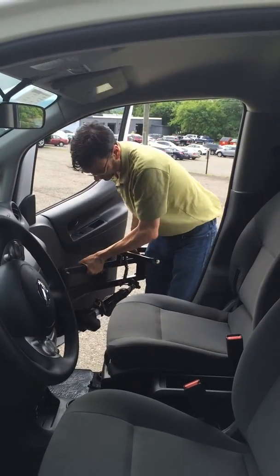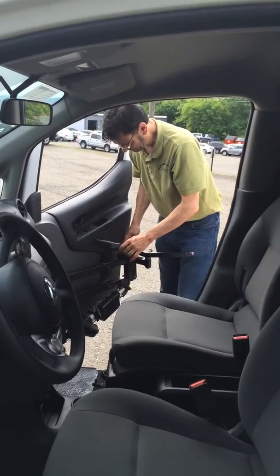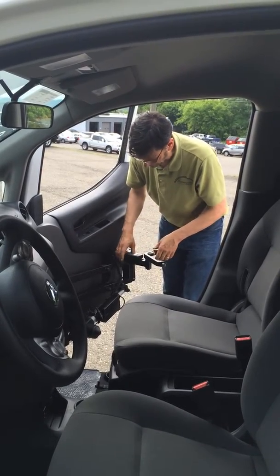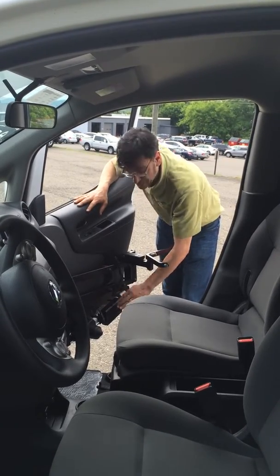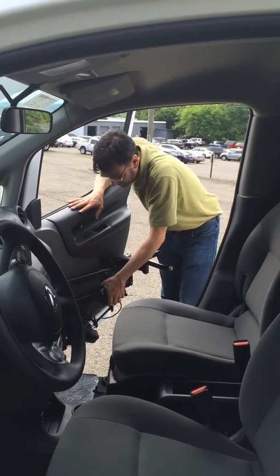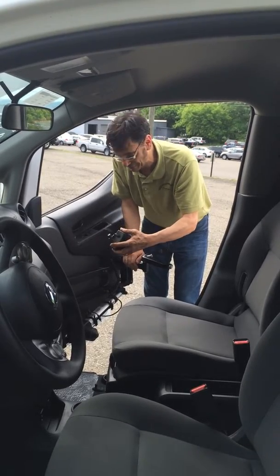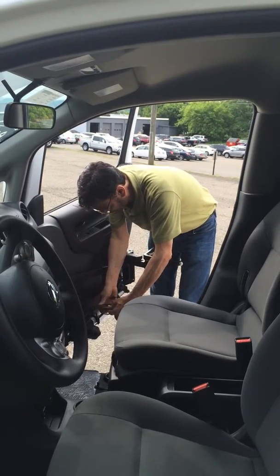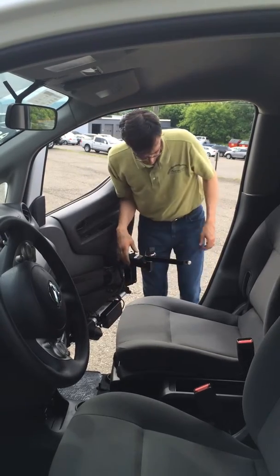Our next step is to put the Multilift on the speedy bar. This is your controller, which allows you to go up and down. You'll notice this unit has the integrated battery system, so there is no battery hookup whatsoever. You simply lift the lift off. If you ever needed to disconnect the battery, you can charge it inside the vehicle or in the home. There are adapters for absolutely everything. Hooking it up is very simple, and then putting it on the holder is also extremely simple.